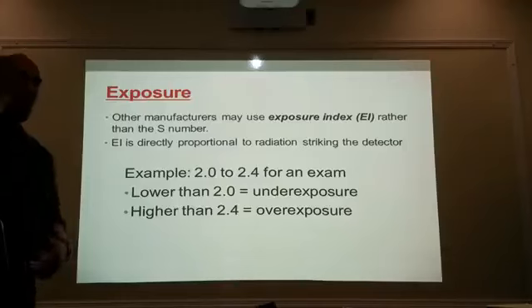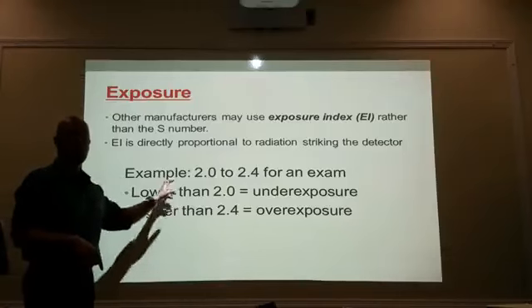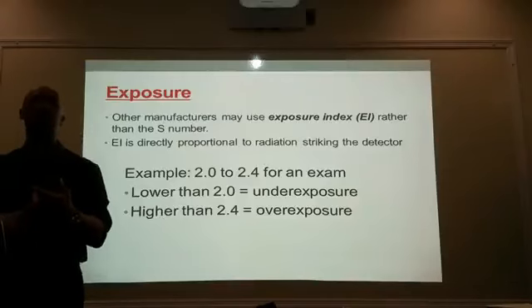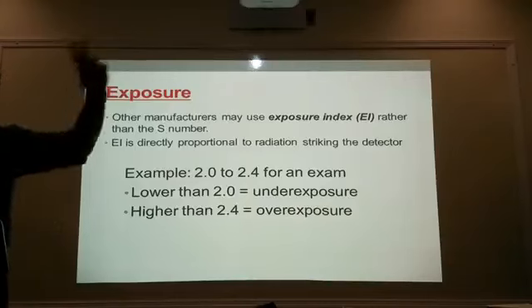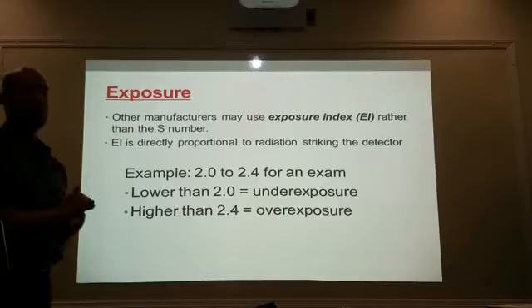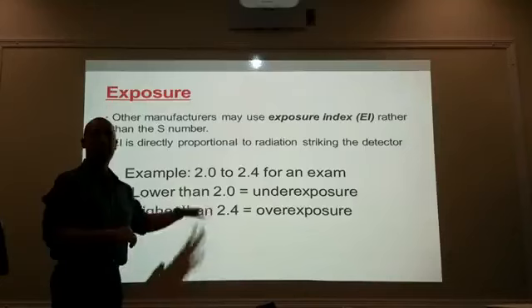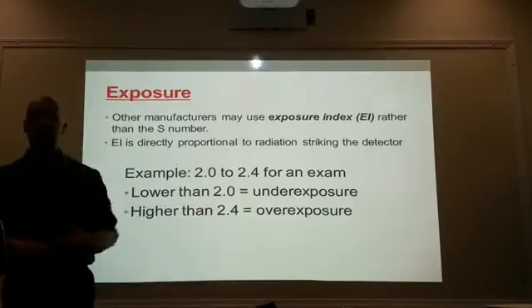Now here in our lab, we have displayed both numbers, both the S sensitivity number and the EI exposure index, so our students understand the concept of both. In the facilities, once you start doing your clinical internship, it's going to be one or the other. And it all depends on who installed the unit.